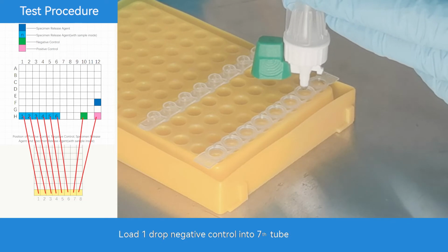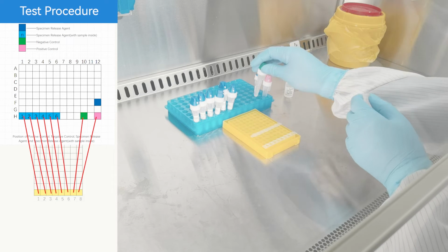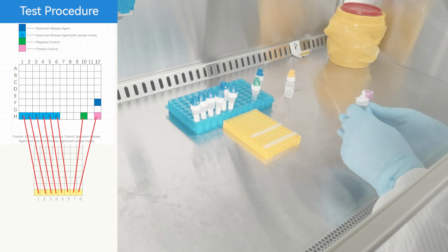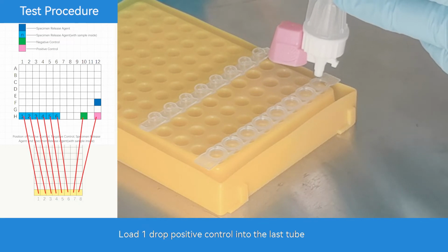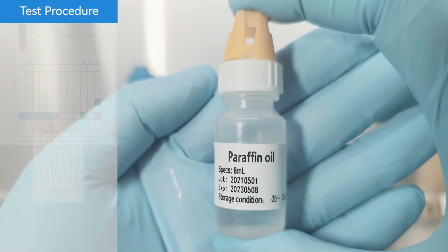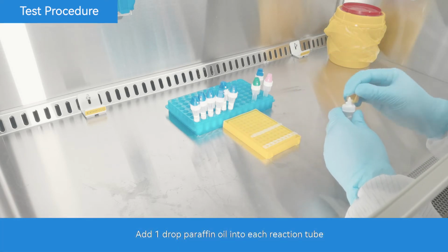Load 1 drop negative control into the 7th tube. Add 1 drop paraffin oil into each reaction tube.